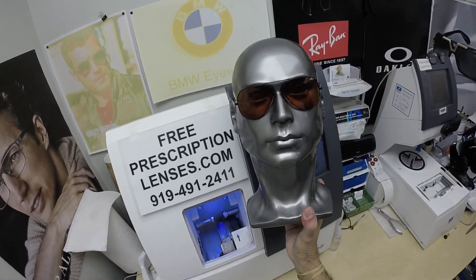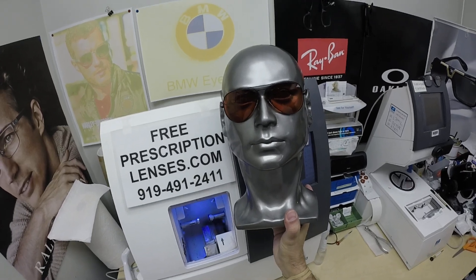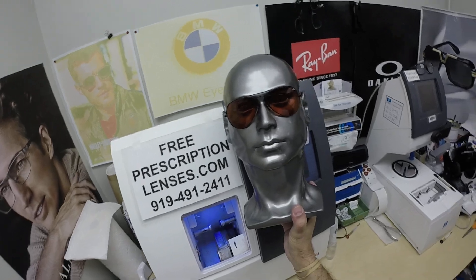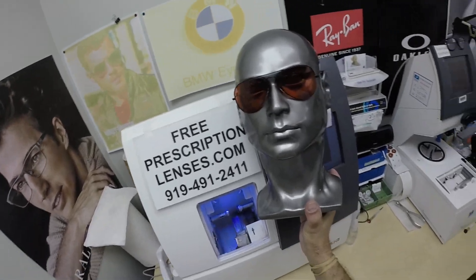These are aspheric lenses, so they have a flatter curvature than a spherical lens that would give you an ugly cosmetic fishbowl appearance. They're designed to fit today's flatter curvature frames. So not only will you look better, your brain will feel better — everyone is better.